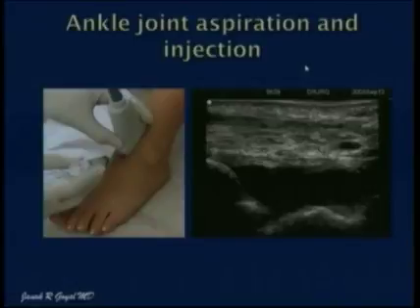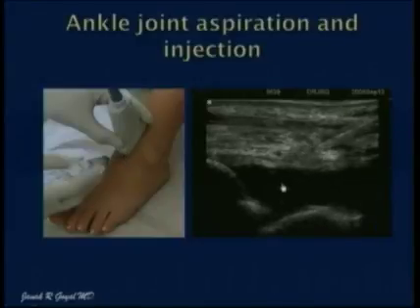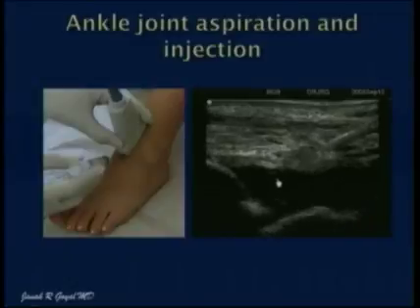Here is the ankle joint aspiration and injection. Somebody had fluid in the ankle joint. This is my patient positioning, and this is the needle which is being directed under direct approach in plane into the ankle joint fluid.